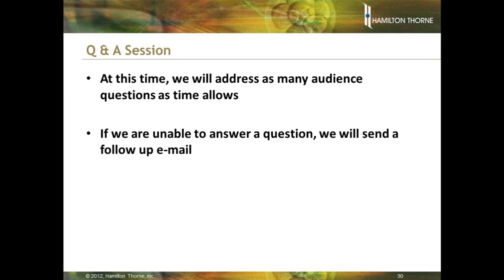Fixing the laser point. The laser has to be focused at exactly the same point as the objective. In other words, you must have the same focal position. When you focus the microscope, your laser must be in focus when it's visibly in focus. So in that sense, we fix it that way. If that's the meaning of the question, that's what we do.